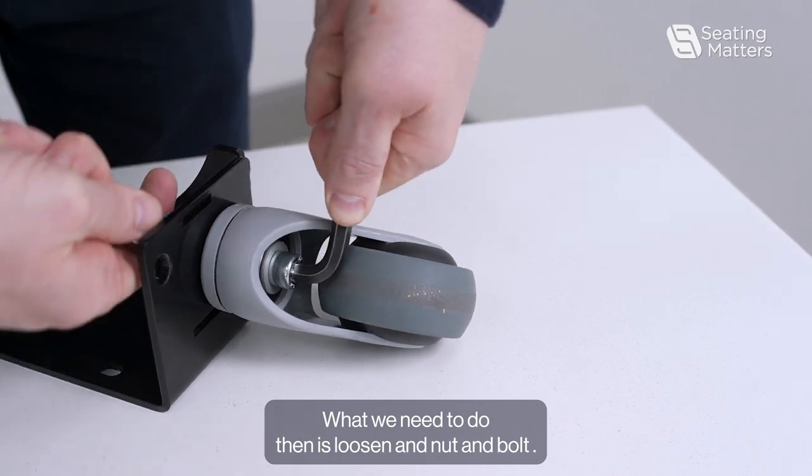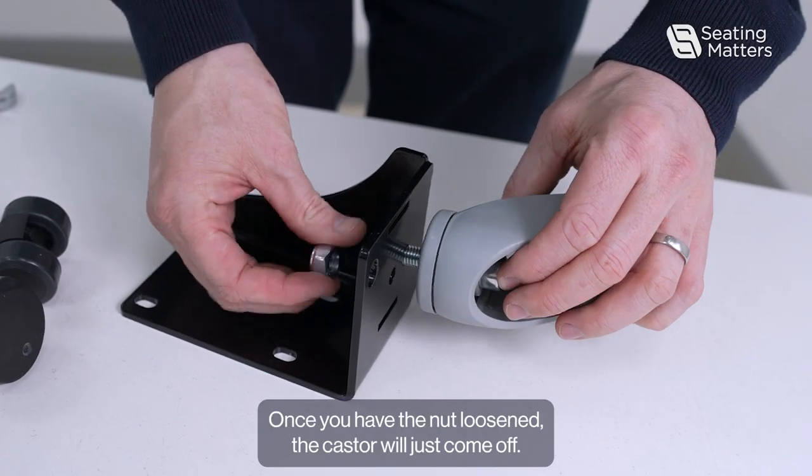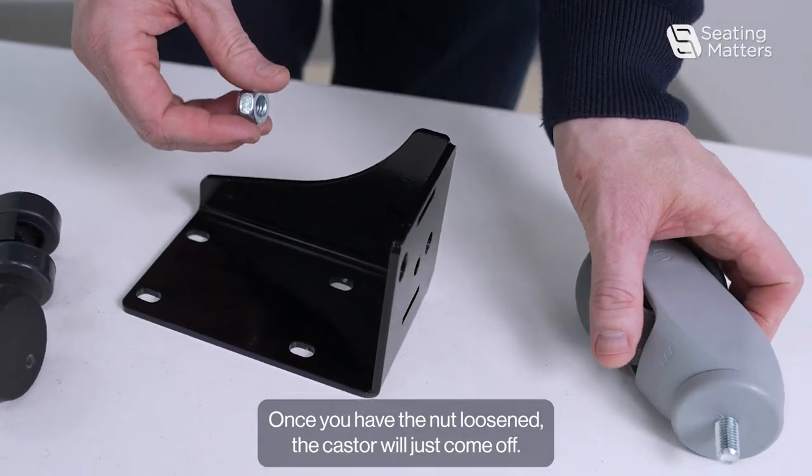What we need to do then is loosen the nut and bolt. Once you have the nut loosened, the caster will just come off.